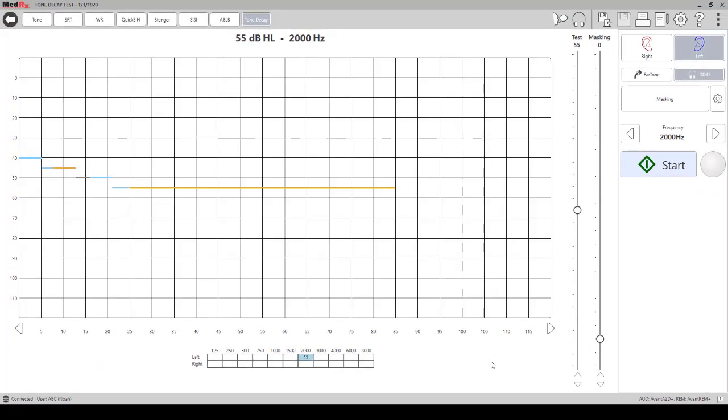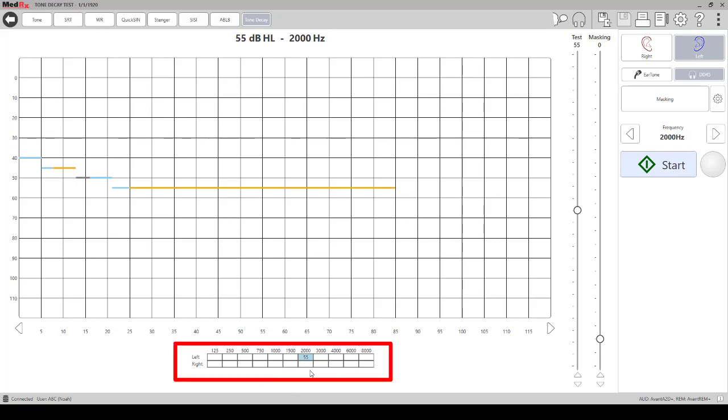You can see that once the patient has completed the testing for that particular frequency, the intensity level at which they heard the tone for 60 seconds will be listed in the table at the bottom of the screen. After this, you can move on and test the other frequencies.